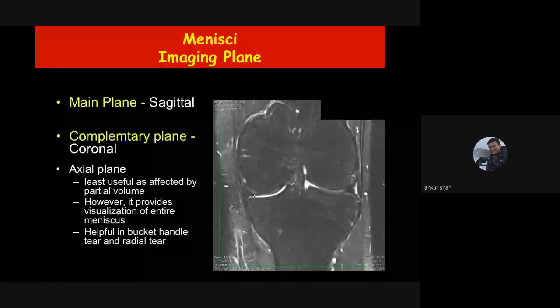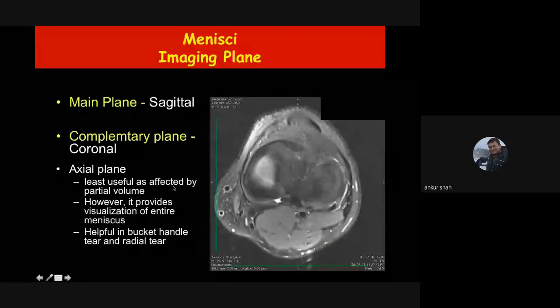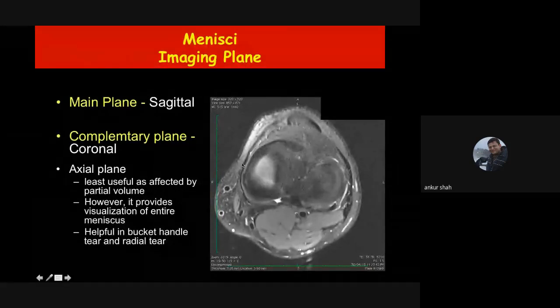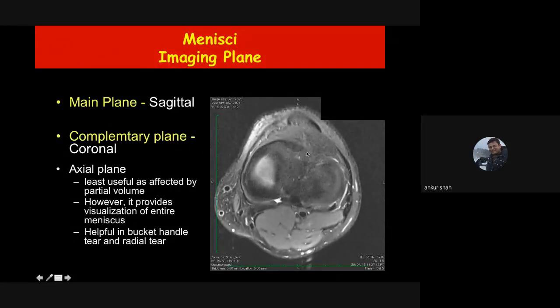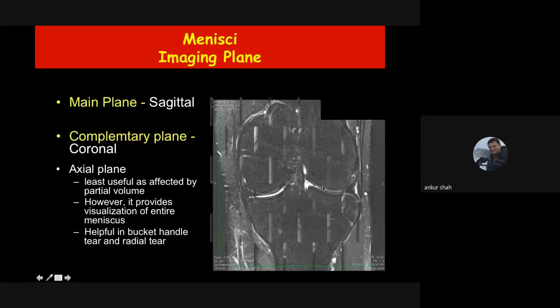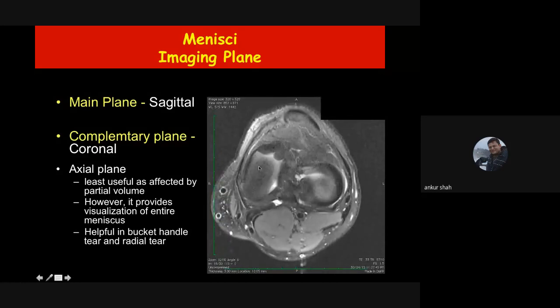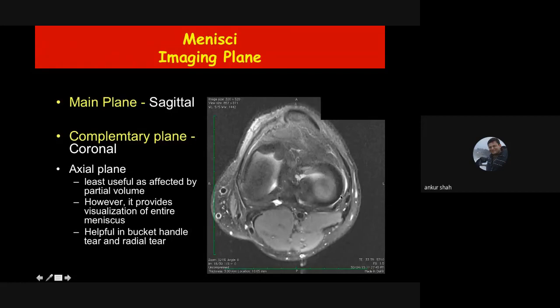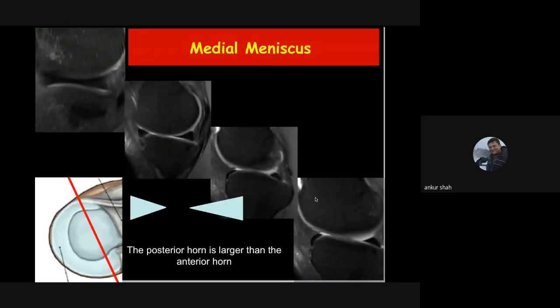The axial plane is least useful due to partial volume averaging, but when sections go perfectly through the meniscus, it is the only plane where you can see the entire meniscus in a single image — seeing the C-shaped medial meniscus. In the mid-part sagittal images you see the anterior horn, then a gap, then the posterior horn. The axial plane is also helpful for evaluation of certain tears like the bucket handle tear.